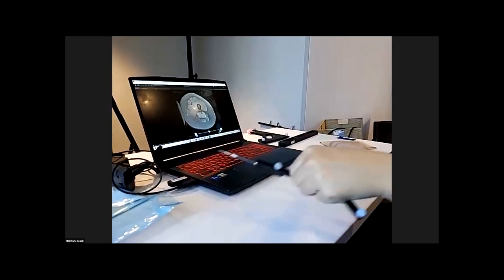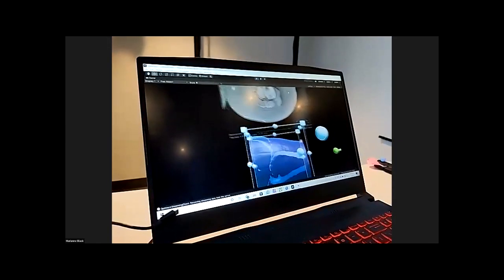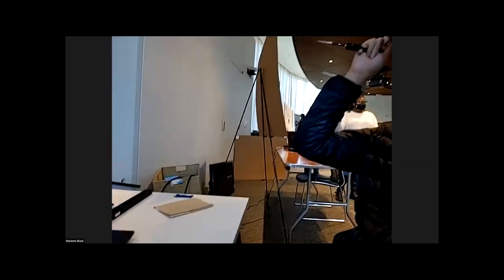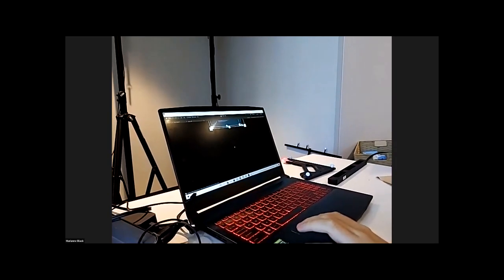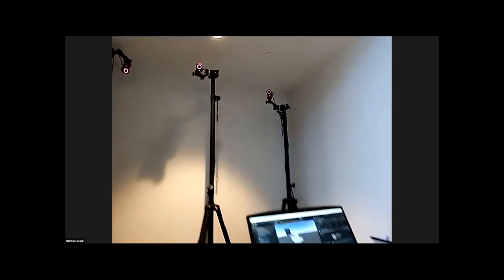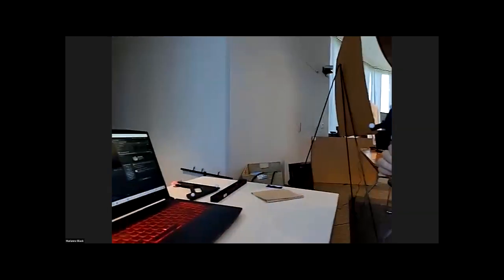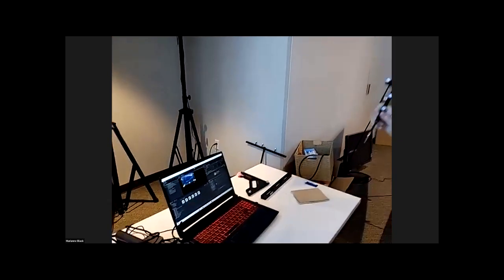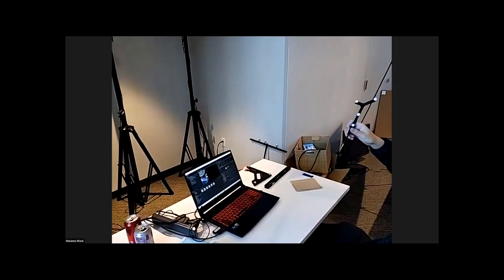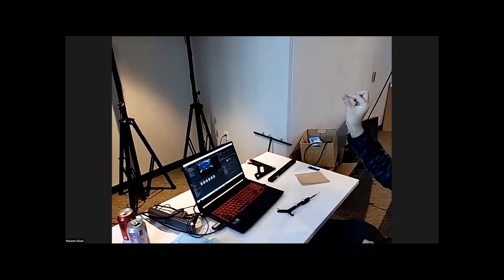So the first thing you see, the blue thing, is a 3D rendering of the 2D MR scans of a patient's thigh. Above that is the 2D MR scan. What we're trying to do is use the OptiTrack system to track the physical probe and relay that location information into Unity. Based on the location of the needle tip, we're constantly updating the corresponding MR scan above the segmentation. Yeah, very cool.